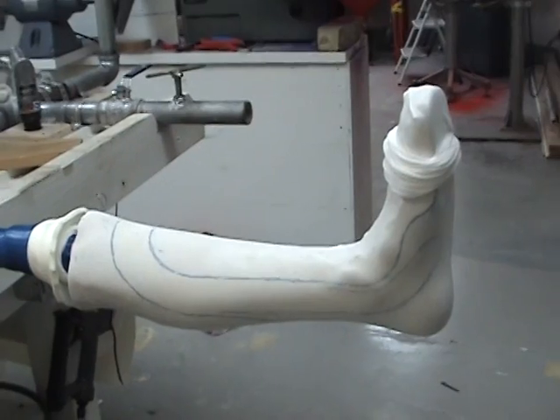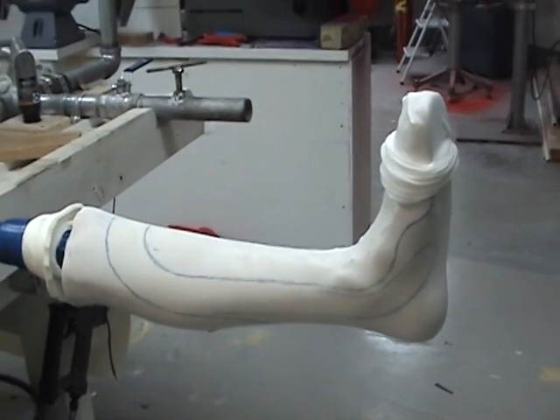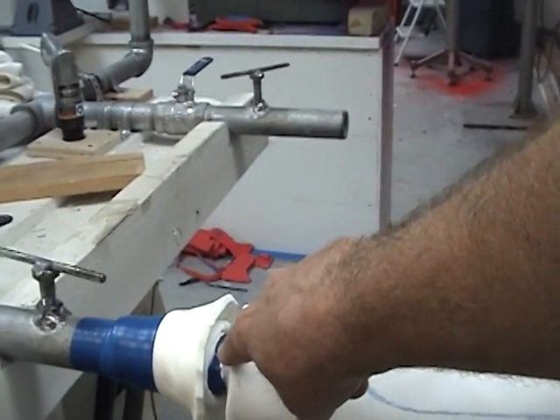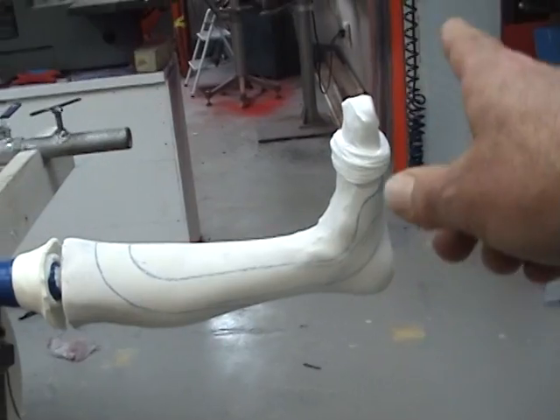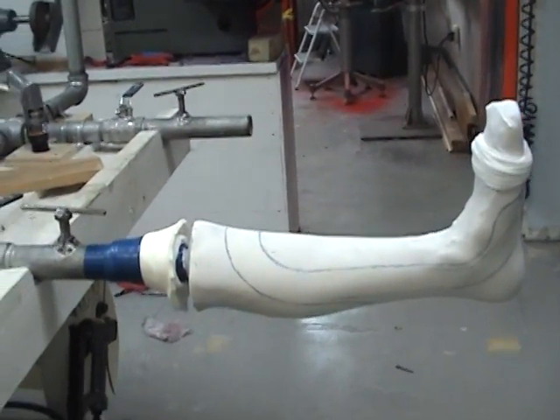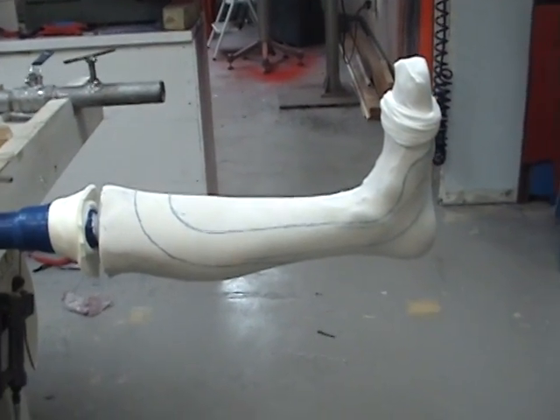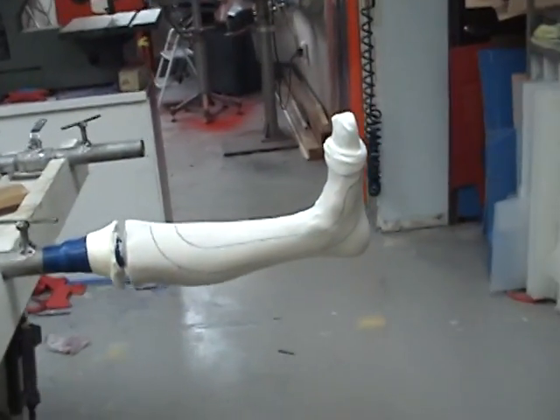This takes a coordinated effort by two to three technicians, and you're about to see their technical ballet. We've got a sock ready to go up here to lock in the strut. We've got the cast separated from the model, and we've got the toe up. We're going to apply the long one-piece strut, then run the nylon up, flip it over, lock it down, and pull the plastic. While two technicians are applying the strut, one technician will be transferring the plastic — it's a coordinated ballet, and we're ready.